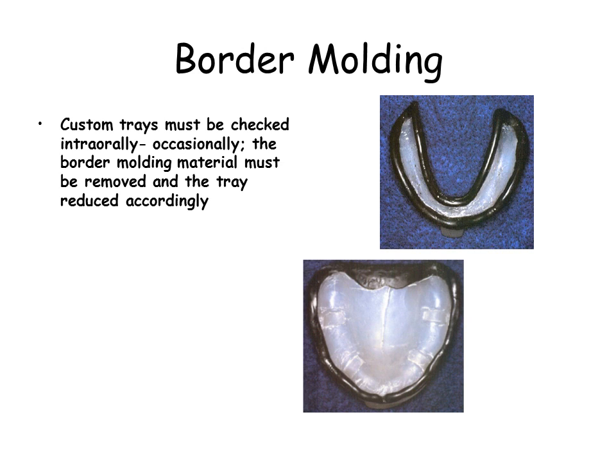Custom trays must be checked intraorally. Occasionally, the border molding material must be removed and the tray reduced accordingly. Insert the tray. Ask the patient to open and close and protrude the tongue.